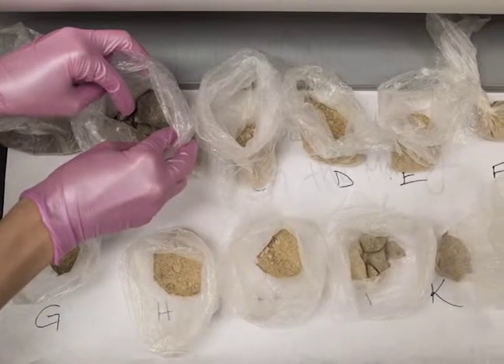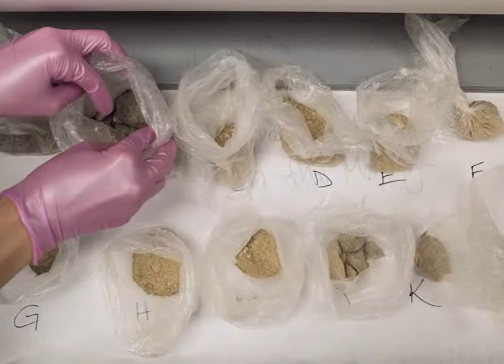Examination of heroin is carried out in the forensic science laboratory using the following procedures, which are mentioned in the Directorate of Forensic Science Working Procedure Manual. Presumptive test, color test: positive results of these tests are only a presumptive indication for the presence of heroin. It is mandatory for the analyst to confirm such results by using alternative techniques. So now we discuss the tests.